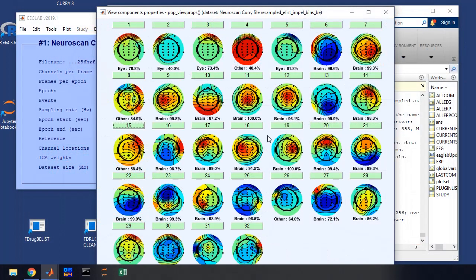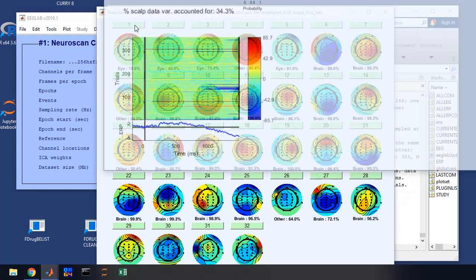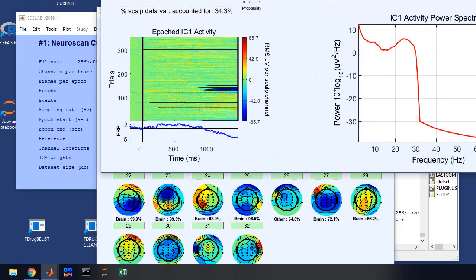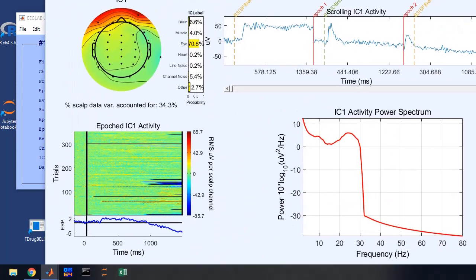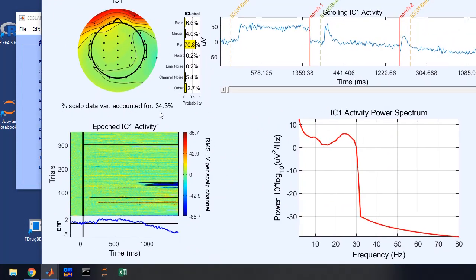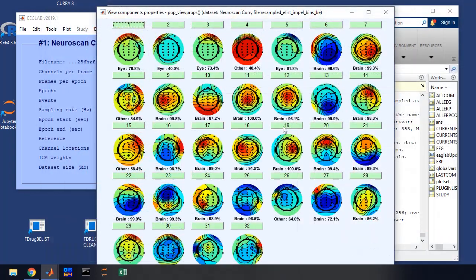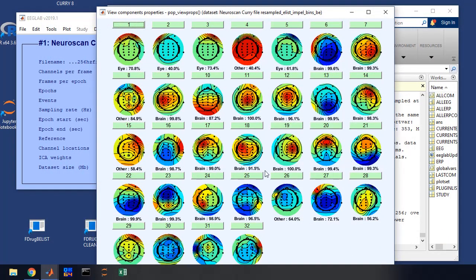The further you go out, the less percentage of data we're talking about. It displays the components based on how much data they represent. So I'm going to go ahead and take this one out. And if you click on one, just for comparison, you can see that that is accounting for 34% of the variance. So big difference there. So I usually look at the first three rows pretty carefully and we take out stuff that's not brain, that's artifact in these first three rows. I'm less concerned about these last rows here, because we're talking about a much smaller percentage of data. Generally it won't have much of an impact on your data processing.